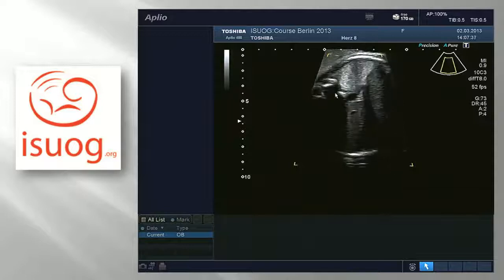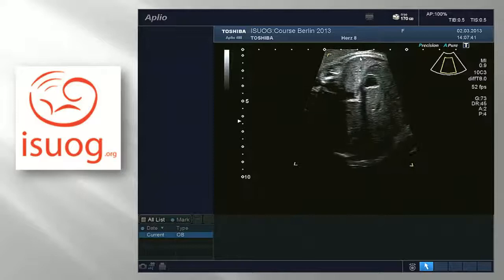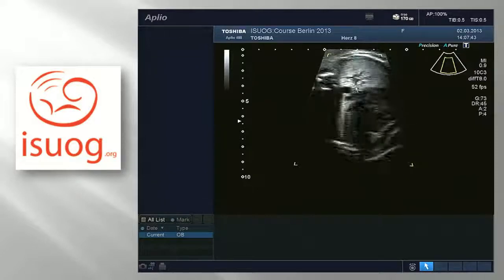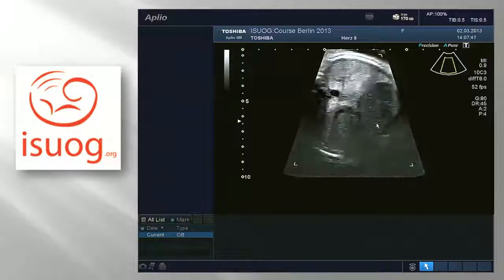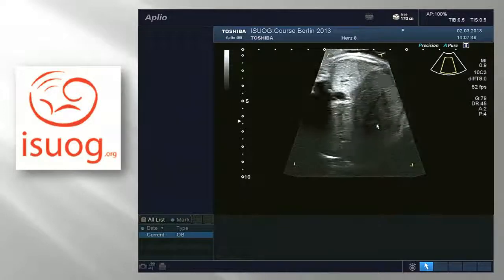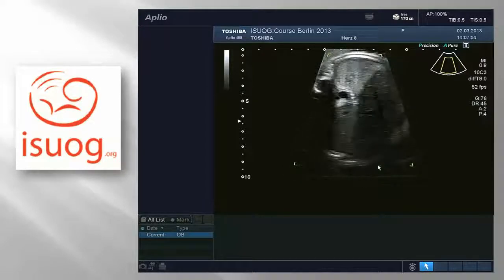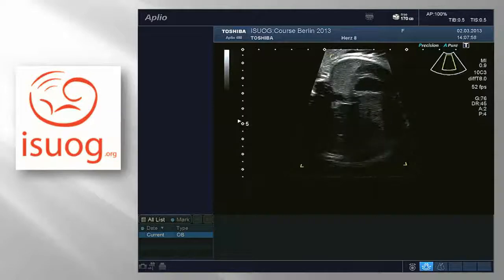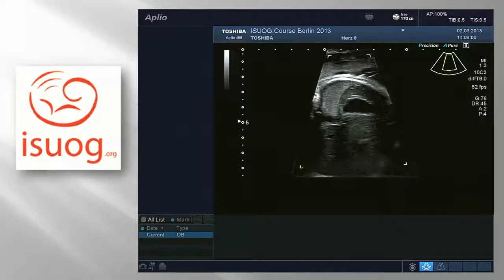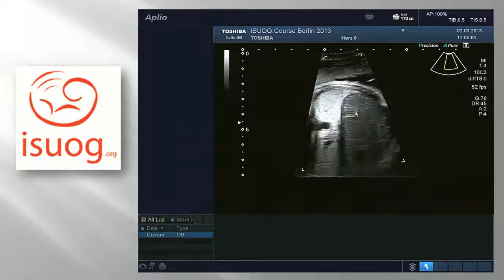quite often, if the spine is anterior, you can get an ultrasound window coming through here, through the ribs. And this view is quite good, actually, for seeing all the heart structures. So I'm going to start by checking laterally. You should have worked that out because this baby's got head down. So this is the, sorry, pressing the wrong button. This is the left side of the baby.